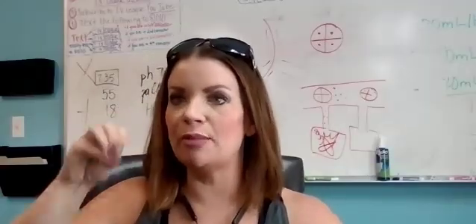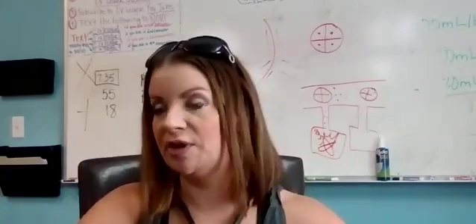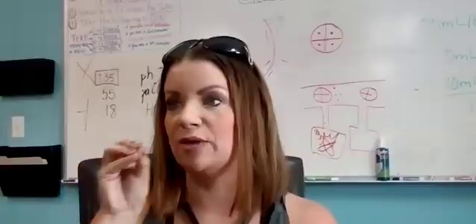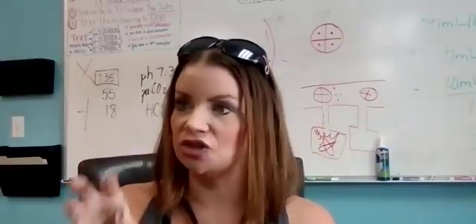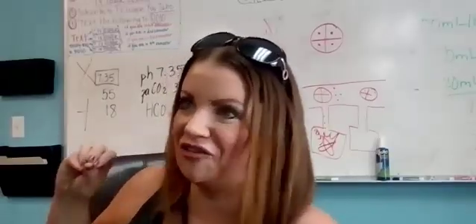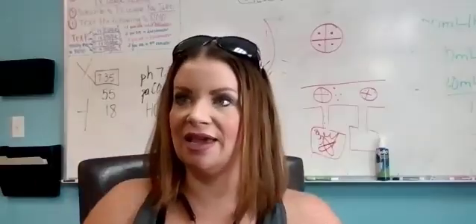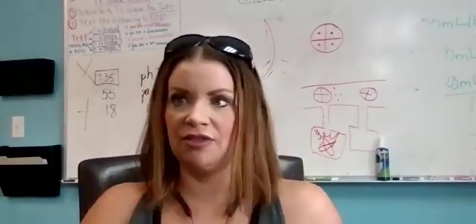So it is, but it's not pushing the lungs open. Y'all understand that? It's only pushing the alveoli open. Now, when you're ventilated, that's pushing the whole lungs, but CPAP and BiPAP are just opening the alveoli, but it is changing the intrathoracic pressure. It's a different pressure, right? It's basically forcing pressure inside. Just think of it like you have two separate systems: your heart system and your lung system.